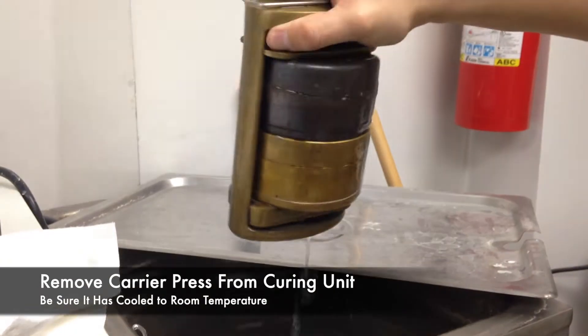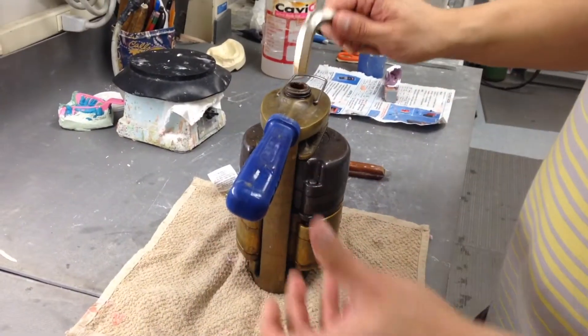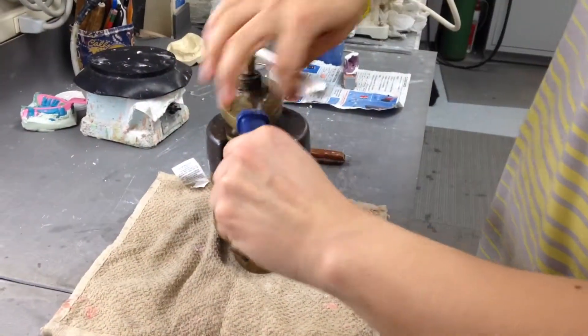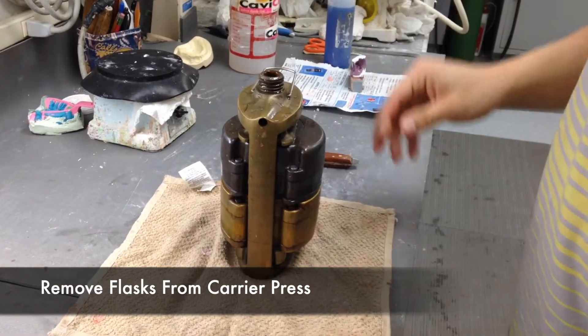To begin, remove the carrier press from the curing unit. Be sure that it has cooled to room temperature — if not, you run the risk of burning yourself. Next, use your key to open up your carrier press and remove the flasks.